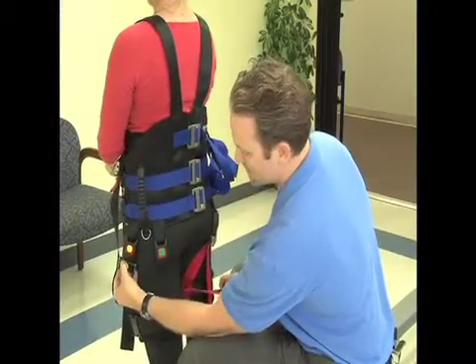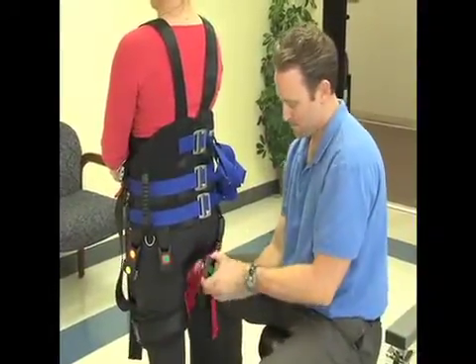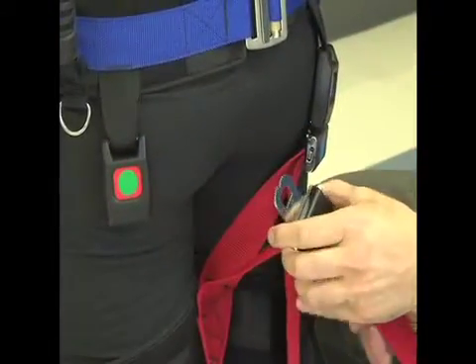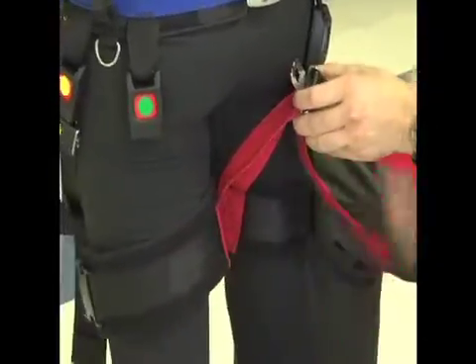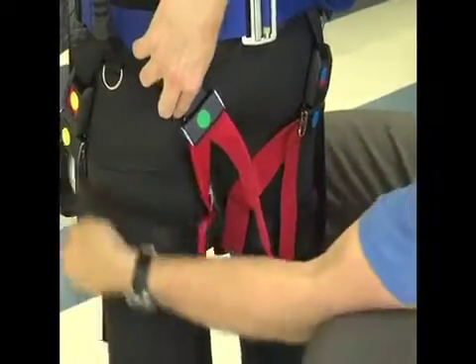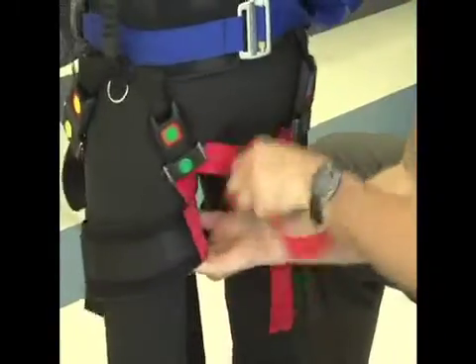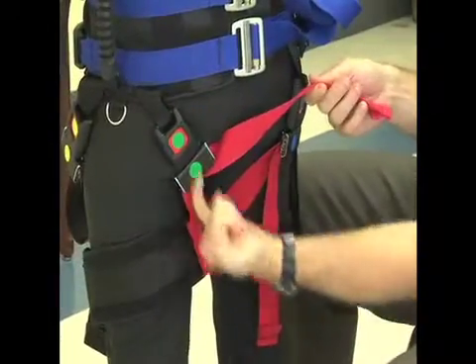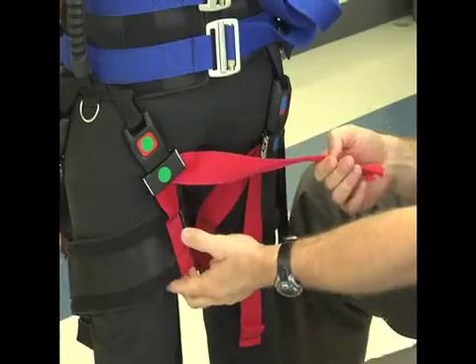Once the buckle is on the outer part of the leg, we're going to come back to the backside and take the red gluteal fold strap, which originates in the inner part of the thigh. We're going to bring it diagonally across the buttocks and make that nice and tight. This is going to be important because this is what's going to help prevent slippage from happening during body weight support treadmill training.